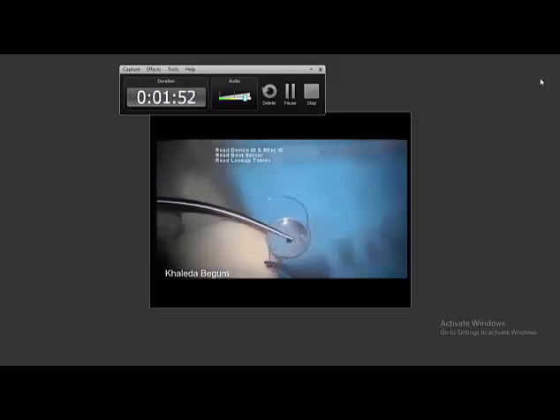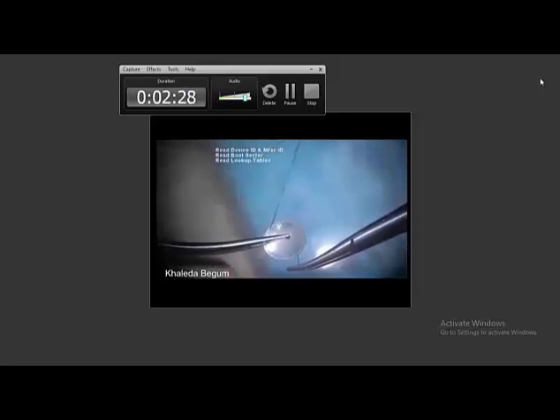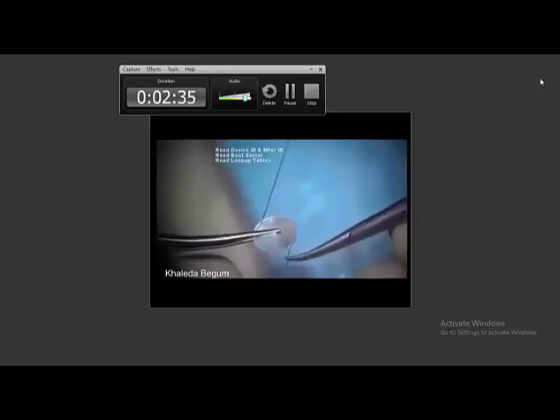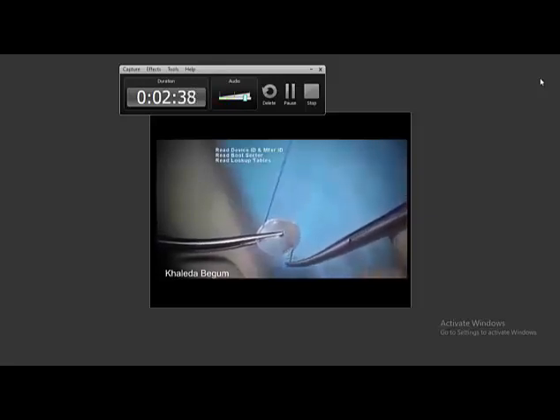Using an Alcon dummy IOL, I first practiced it in the OT. The haptic is separated, and as you know, a multi-piece IOL has a haptic made of 5-0 prolene. After separation of the haptic, I place the prolene into the port where the previous haptic was fixed. Then the other haptic is removed and the 5-0 prolene is fixed.